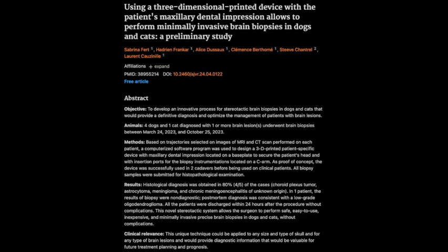Of course, like any new technique, there are limitations. The most significant one is the small sample size. They only tested it on 5 animals, so larger studies are needed. That's understandable. It's still early days for this technology. Precisely. They also acknowledged the lack of necropsy data for all the animals. Having that information would provide a more complete picture long-term.